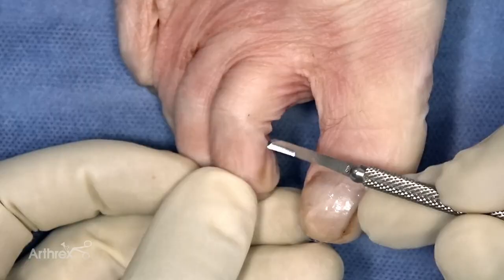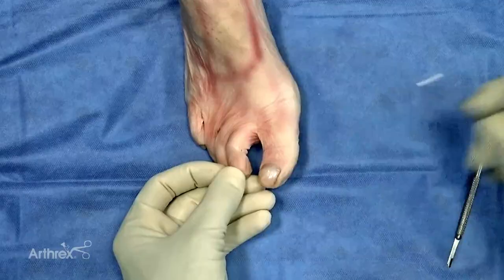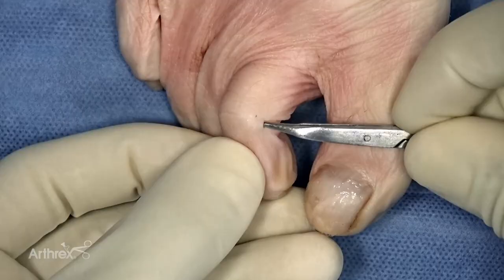be made. I make a stab incision through the skin, and I confirm that on C-arm fluoroscopy. I'll bluntly dissect straight to bone, and I'll elevate the extensor tendon and the capsular tissues at this level. At this stage, the burr is inserted within the joint.